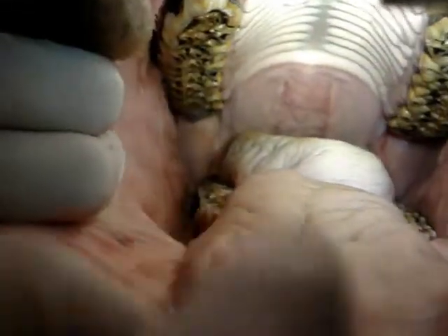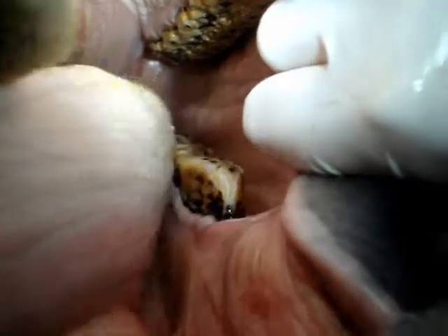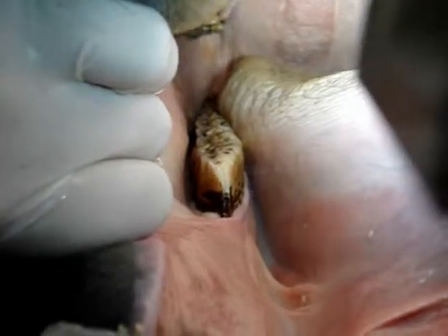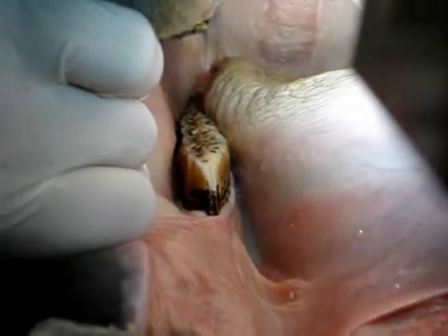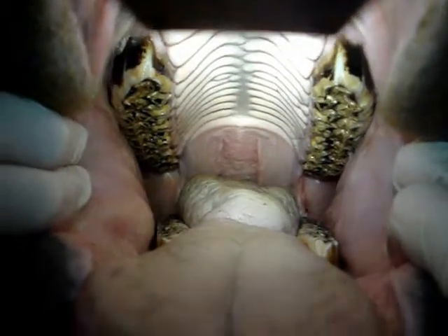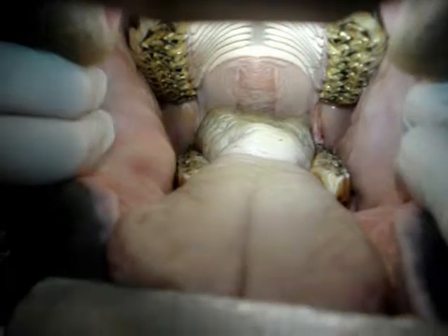Now a final check of the arcades is done. We are checking to see that the arcades are level and that they possess the proper angulation, and that all sharp points have been removed. We will also assess any problem areas and the corrections that have been made. Since some tall teeth cannot be taken down fully in one visit due to the danger of pulp exposure, a recommendation will be made for when a follow-up procedure should be done if needed.